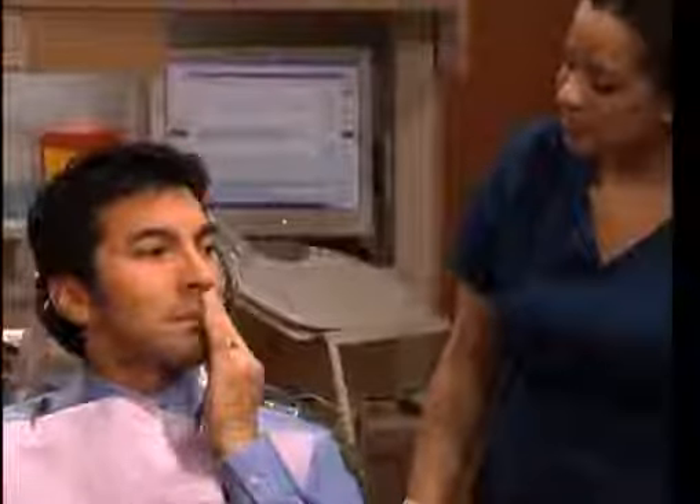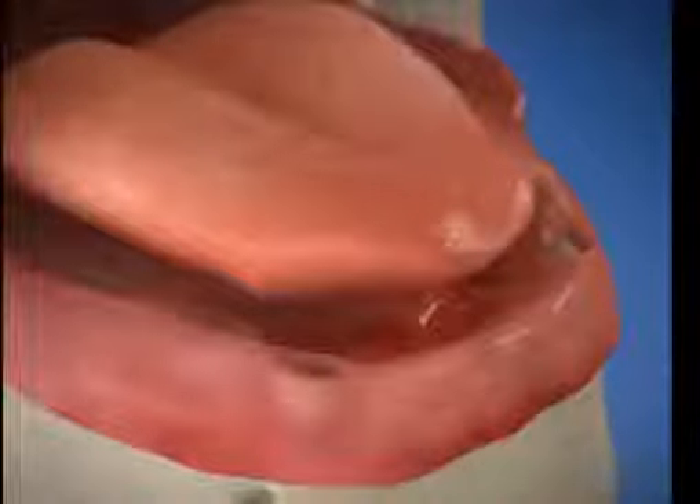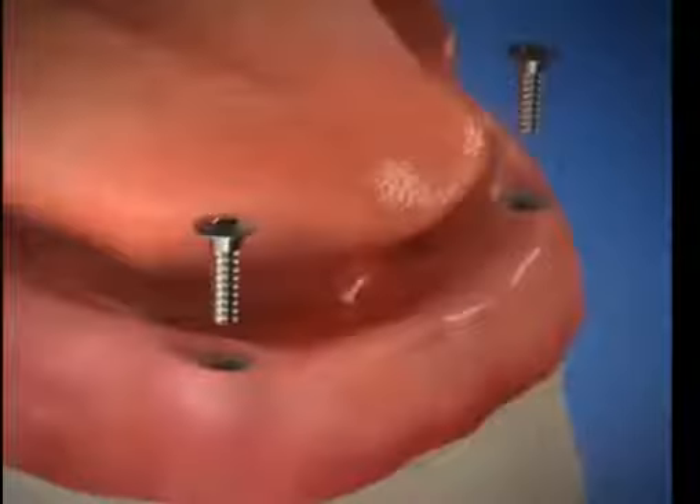We'll begin the procedure when we're sure you're comfortable. Openings are made in your gums, and a channel for each implant is made in the bone. Then we place the implants into the prepared channels. Covers are placed on the implants, and the gums may be stitched closed for healing.